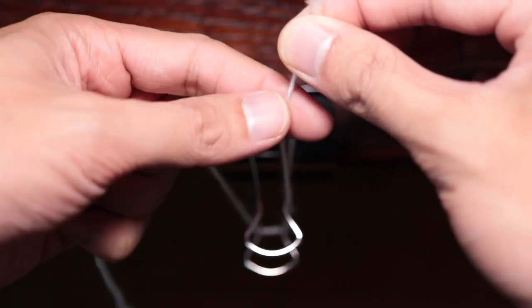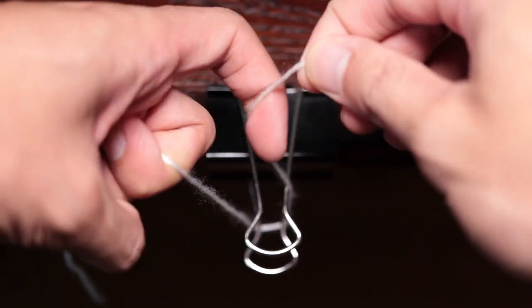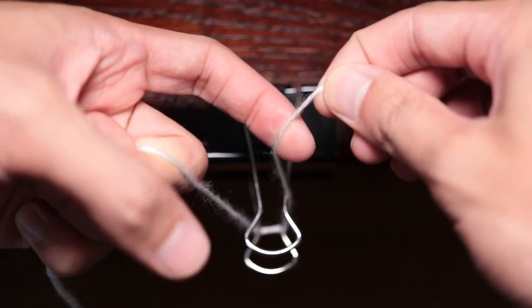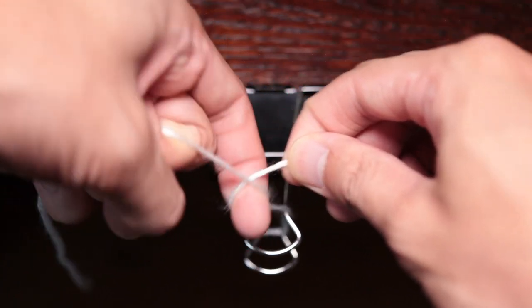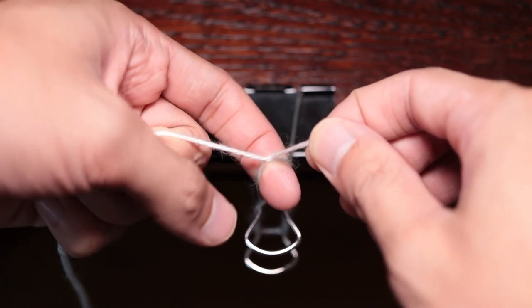Starting with the index side, you hook onto the free end—it's always the free end first and then the other end of the string. You're hooking it toward that hand and then going under the other string.